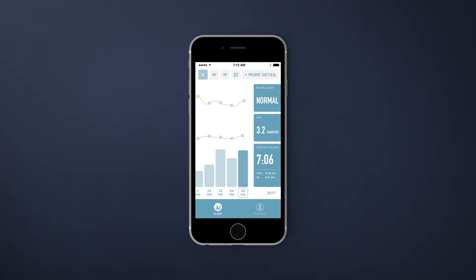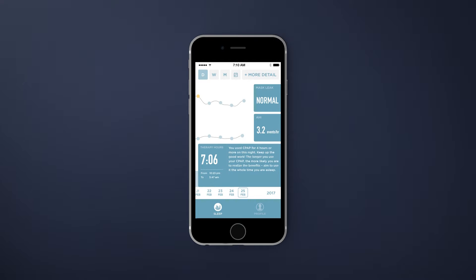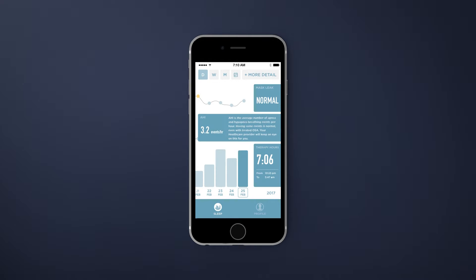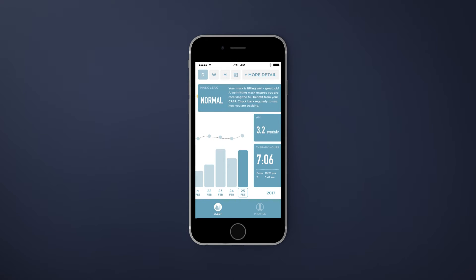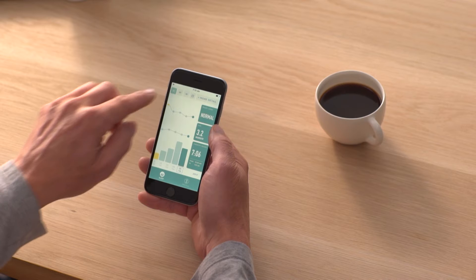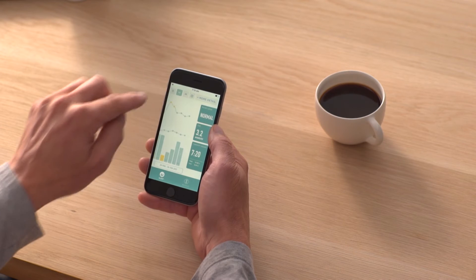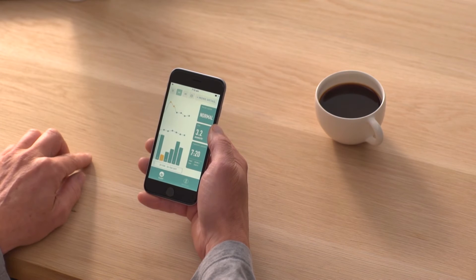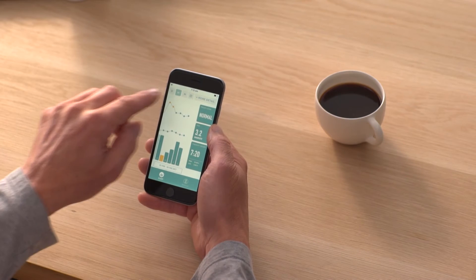You can easily track your three most important therapy metrics and see how they changed over the last few nights, over a week, or over a month.